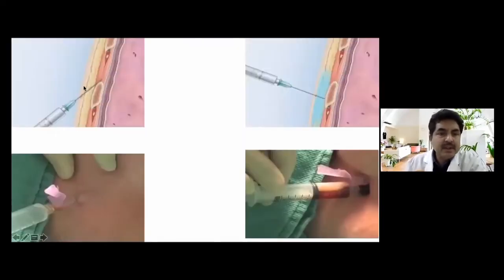How can you push? Like this. You have counted the ribs, you have marked the site earlier, then you put the needle in oblique fashion, not in a vertical fashion. Before putting, you may make a flare in the skin. You know the skin is very pain sensitive, and the other structure is the parietal pleura. So once you are putting the local anesthetic agent during the chest drain, you have to respect these two things to avoid the pain. One is the skin, the other one is the parietal pleura. These are the two most painful parts.